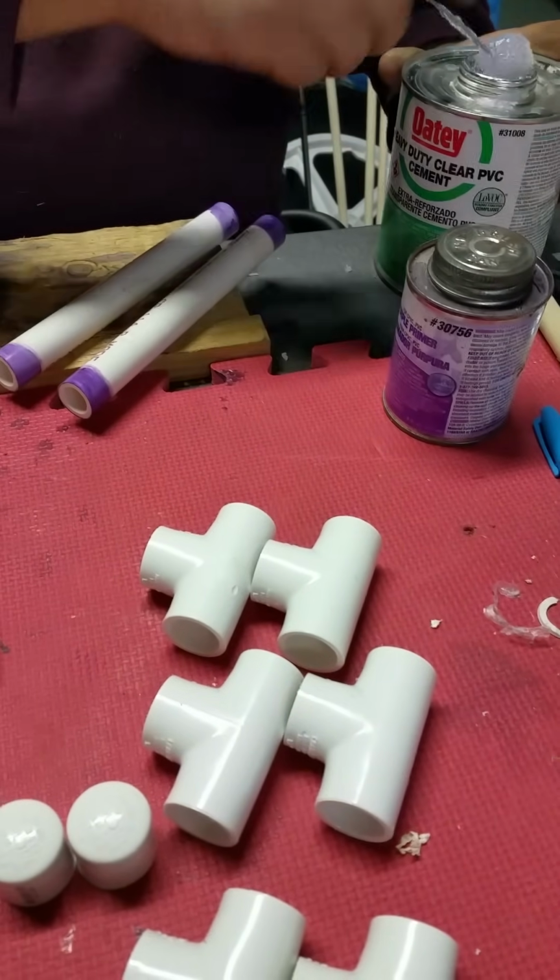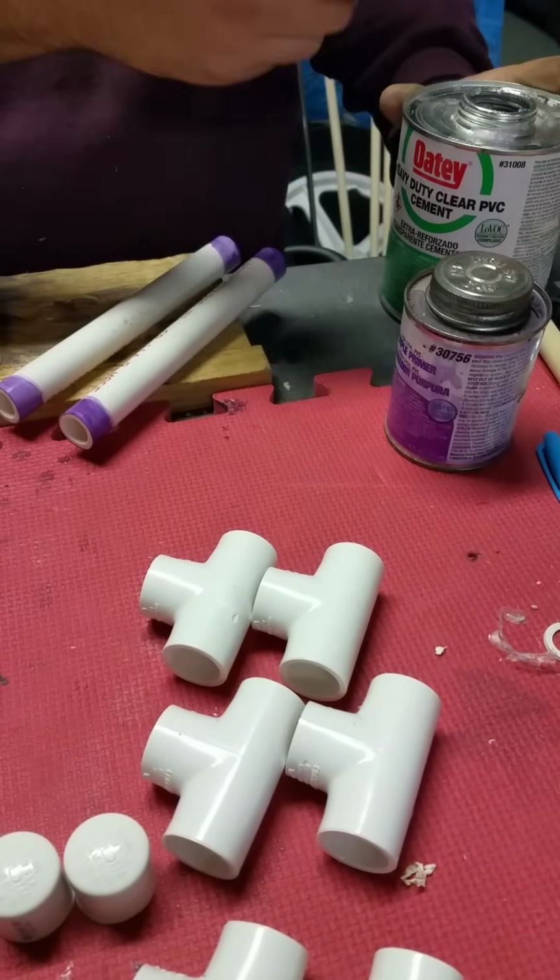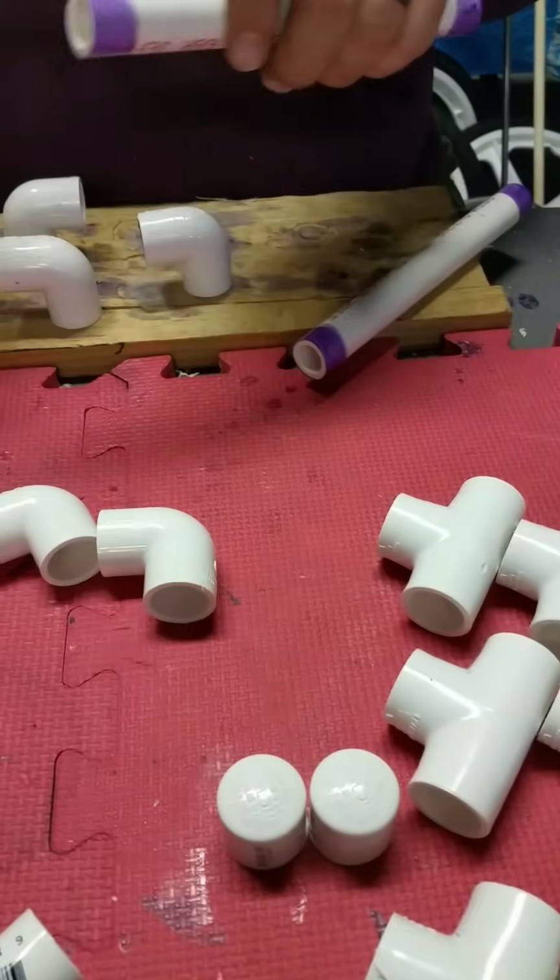When you apply your glue, you want to put on a thin layer. Don't overdo it. It'll just make a big mess that you have to clean up.